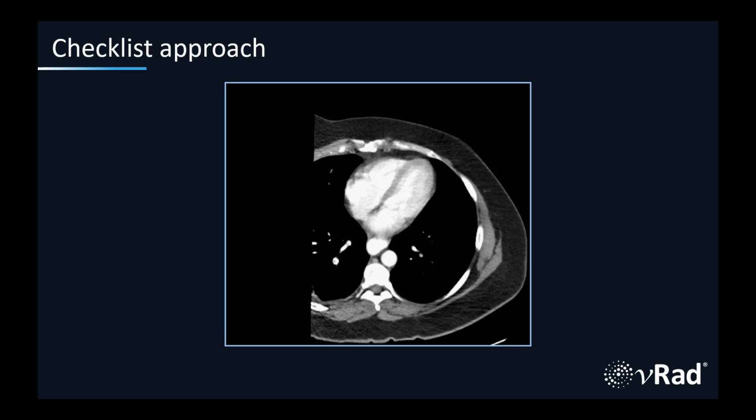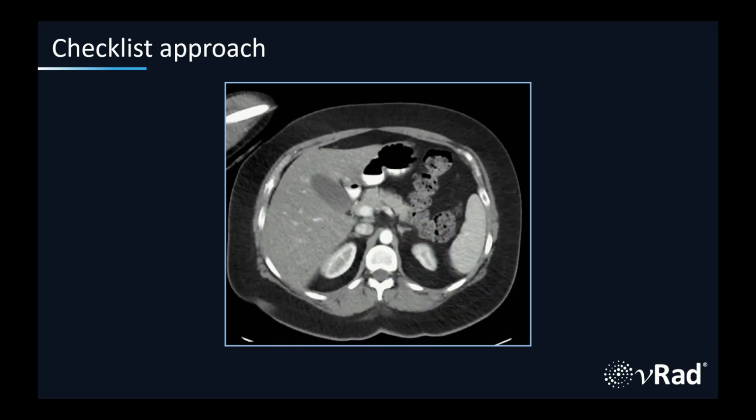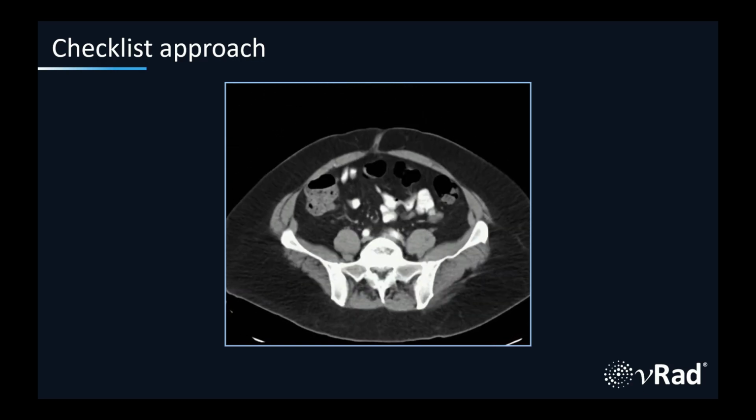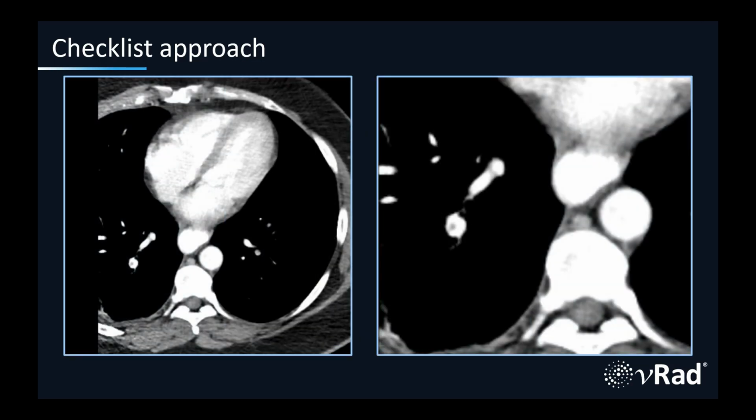This is an abdomen pelvis CT done for the indication of right upper quadrant pain. There were 479 images, including the coronal and sagittal recons, in this abdomen pelvis CT. There are no acute findings in the abdomen or pelvis. The finding was on image 1 of 479. And there it is. There's the pulmonary embolism. So you could have diagnosed this by using your checklist approach. However, you could have also used some secondary signs to help you make the diagnosis.